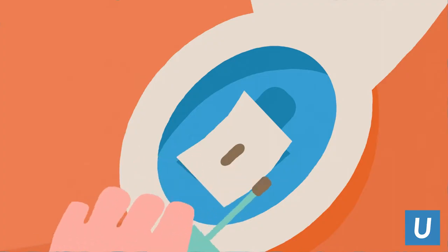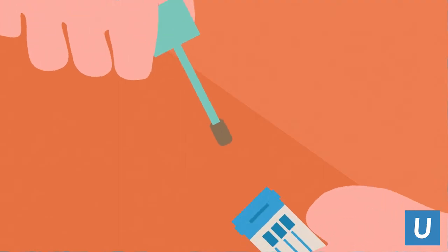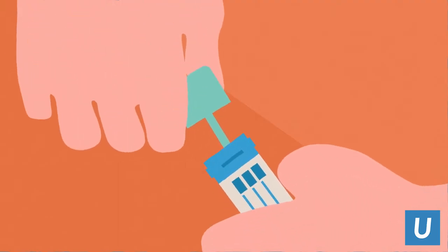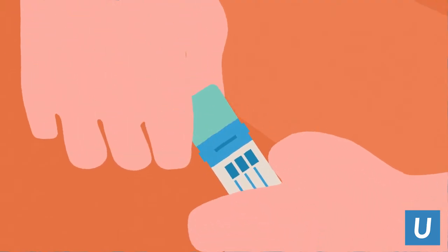The grooved portion at the tip of the wand should be completely covered. Now, reinsert the wand into the sampling bottle and snap the green cap on tightly. Do not reopen.